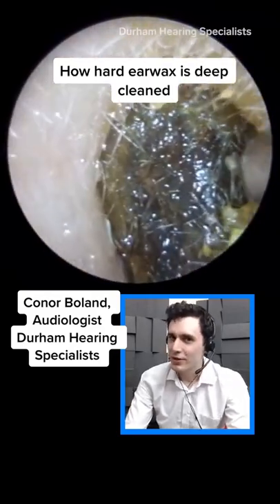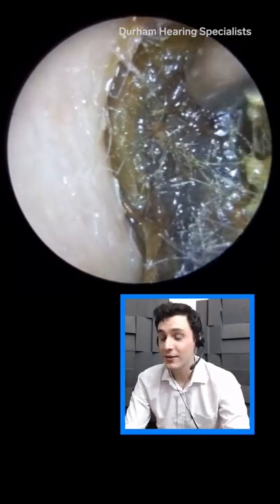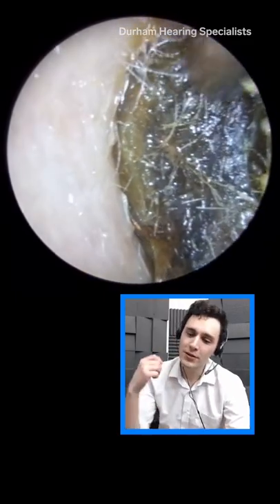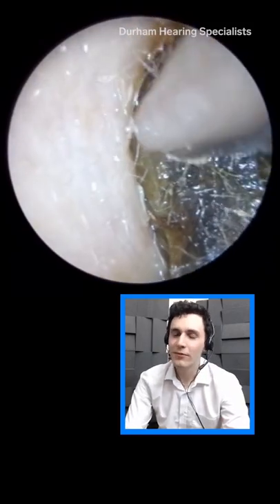When I first saw it, I thought, oh, this will be an easy job because the wax is right there. You can see it with your naked eye. So it's all good. But then as soon as I tapped on it with the probe, I thought, right, we're in for a heavy ride here.